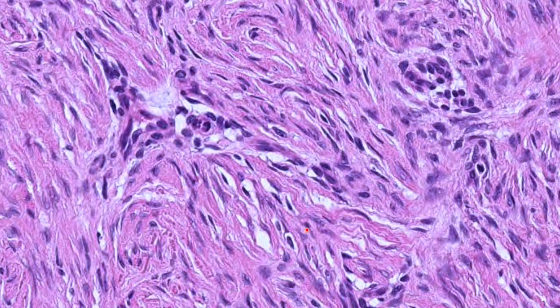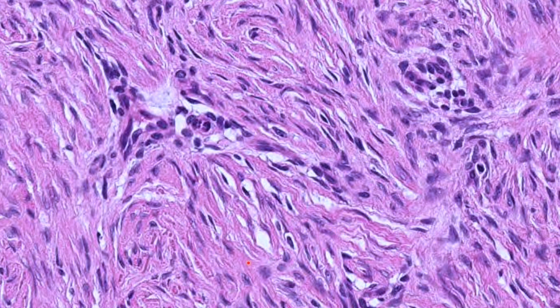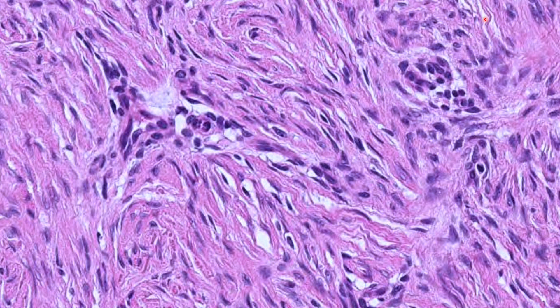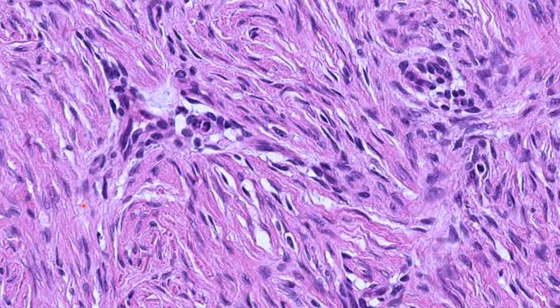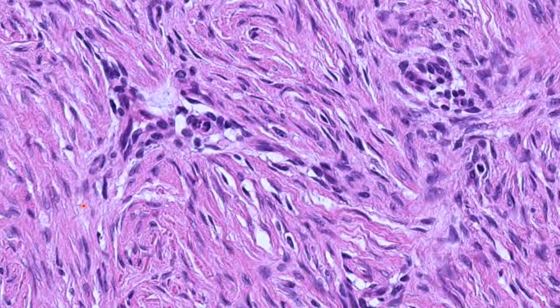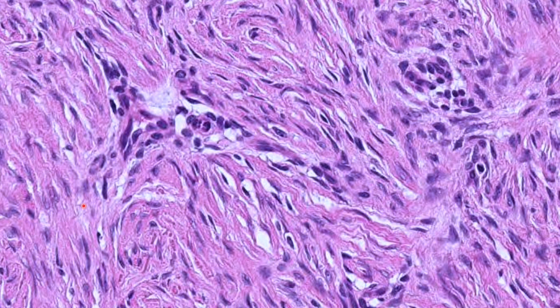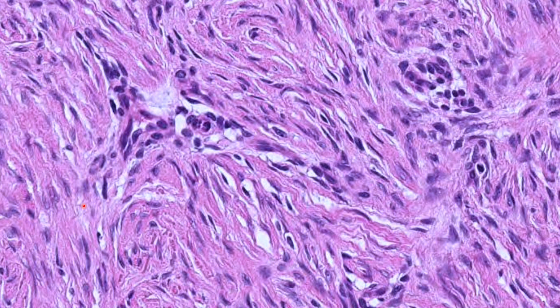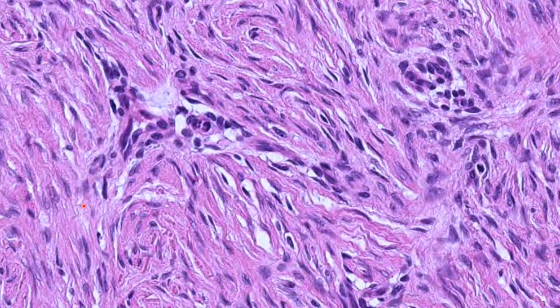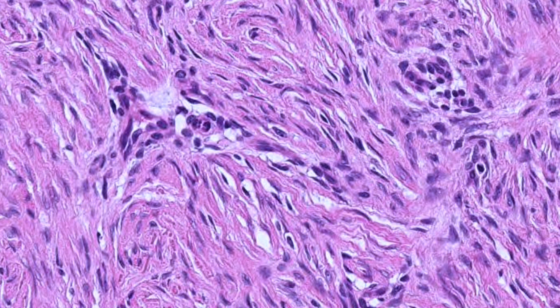The cytoplasm is not a uniform dense pink blotch — if you look carefully, it has fibers laid on it. Everywhere you see the cytoplasm, there are layers of wavy fibers. These are collagen fibers. So this is how a fibroblast looks: very thin nuclei with lots of wavy collagen fibers surrounding them. This is from a DFSP case. Any fibroblastic tumor will have a very thin cell with ample pink cytoplasm and wavy cytoplasm characteristic of fibroblasts.